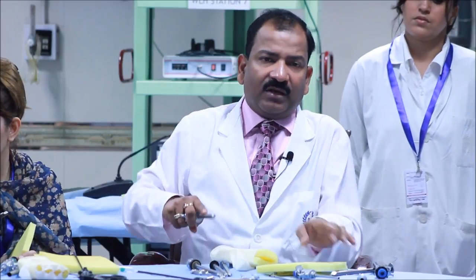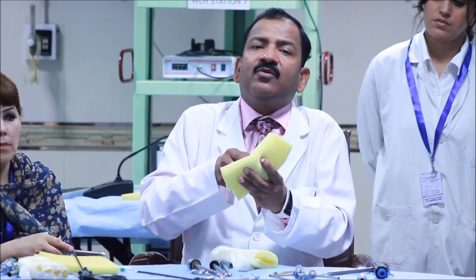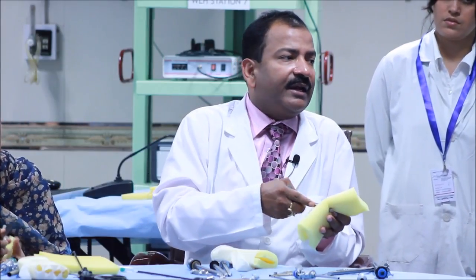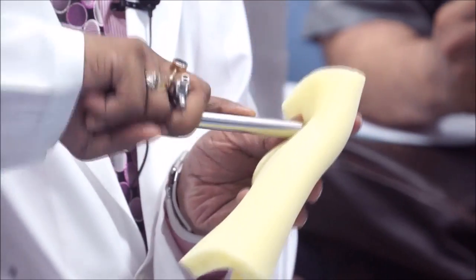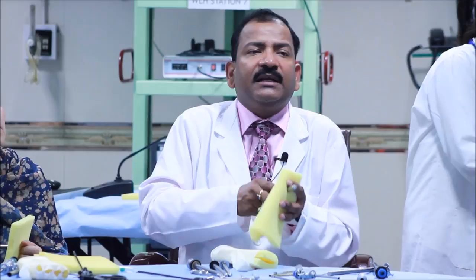Suppose you are going into this sponge, and you are going there, it will stop you going in inadvertently. You should rotate it and then it will stop you halfway. You got my point? So keep it there, don't push it, just keep it there and keep on rotating your hand. And automatically it will drill and then it is stopped. So that inadvertently you will not pierce the trocar into the aorta or vena cava or bowel.